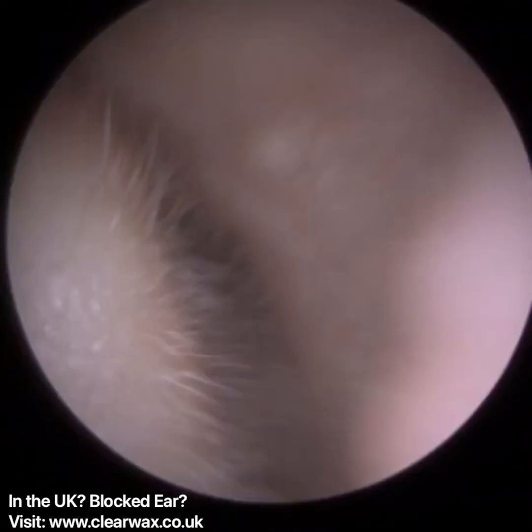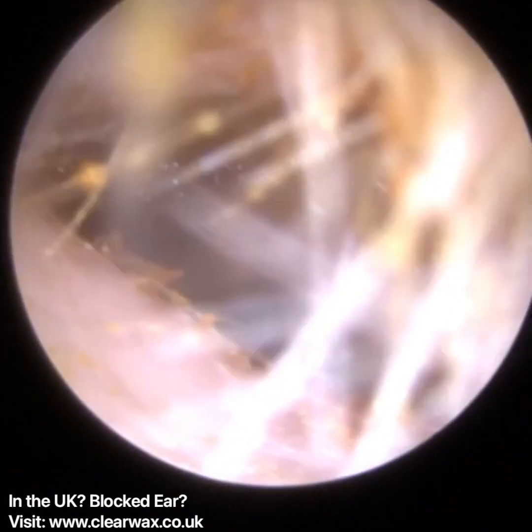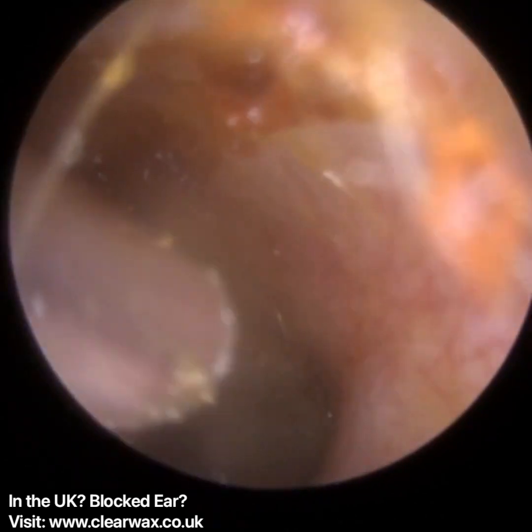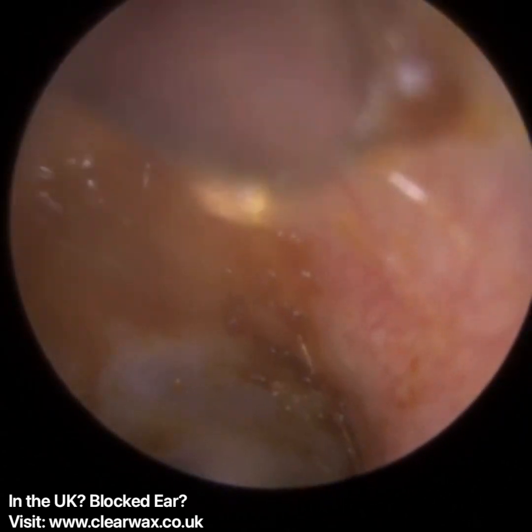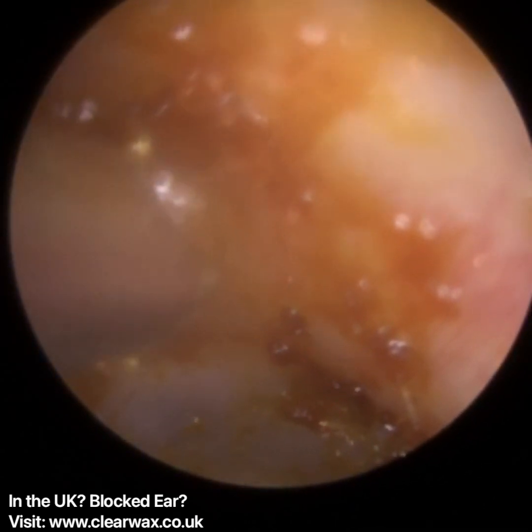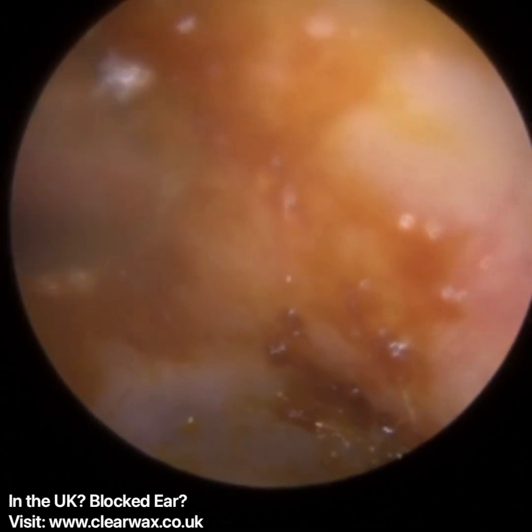So you can see there's a few hairs there. Just suction that out. The ear's clear now. Again, I'm just going to see if I can hover over it, because sometimes when you hover over it, it's not a problem. It just peels away. But the last thing we want to do is scraping and scratching and applying pressure on the bony part of the ear canal.